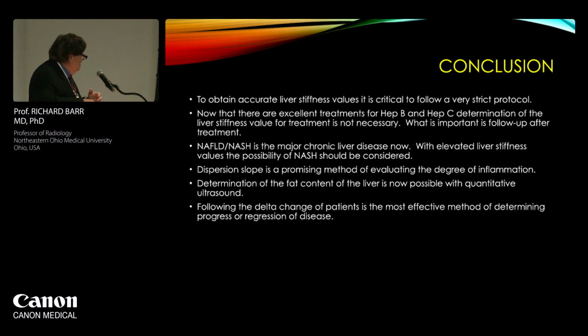And again, we can really quantify fat really well, which Dr. Ferrioli will talk about. And I think just looking at the change over time is really good for us to decide if a patient's getting better or worse.